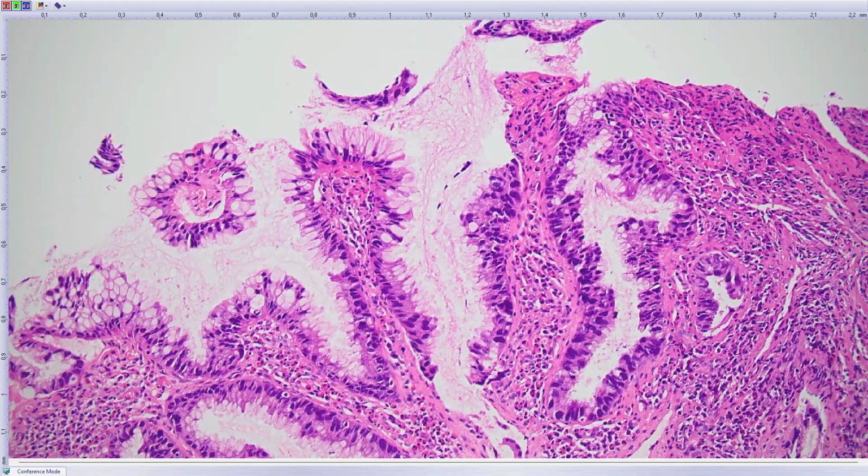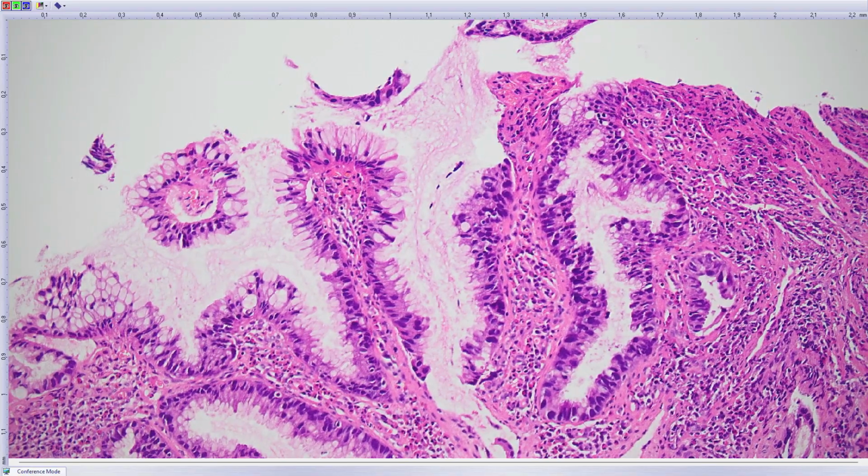So I believe this patient is at very high risk of having adenocarcinoma. And if clinicians did not see anything, no polyp, no mass lesion, it's a random biopsy, the patient is a candidate for prophylactic colectomy, definitely. Okay, so I believe that the gland on the right is very, very dysplastic. So: non-conventional type of dysplasia, IBD related.